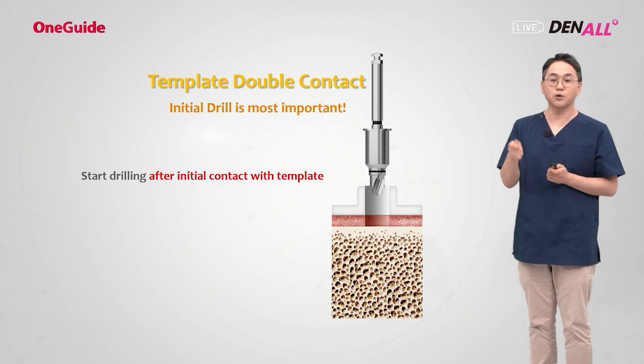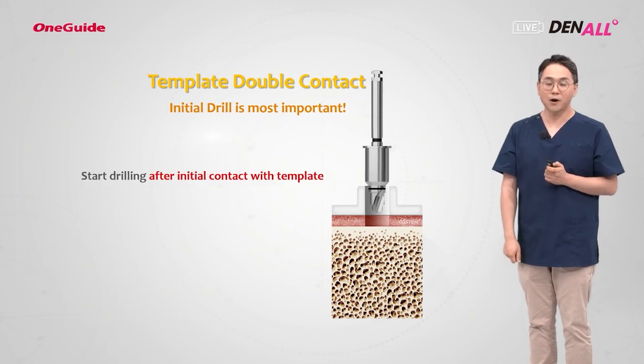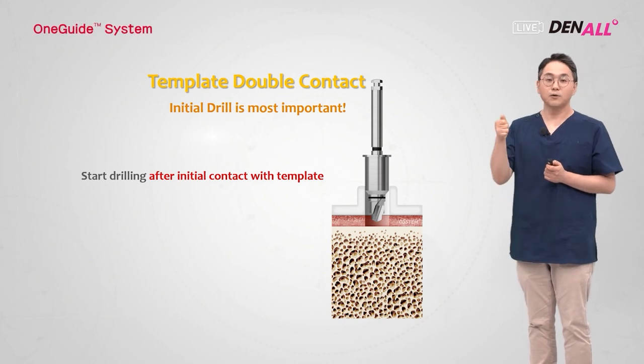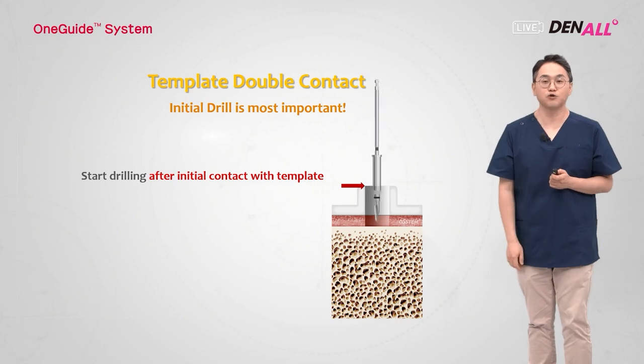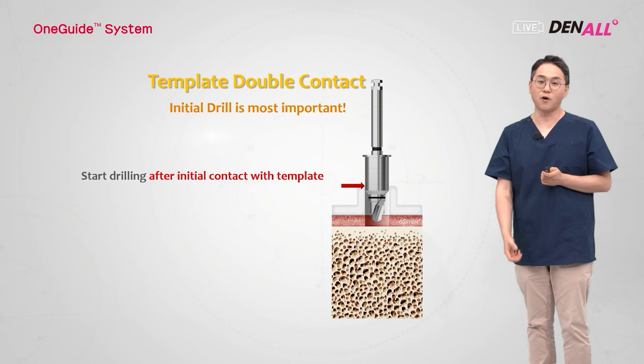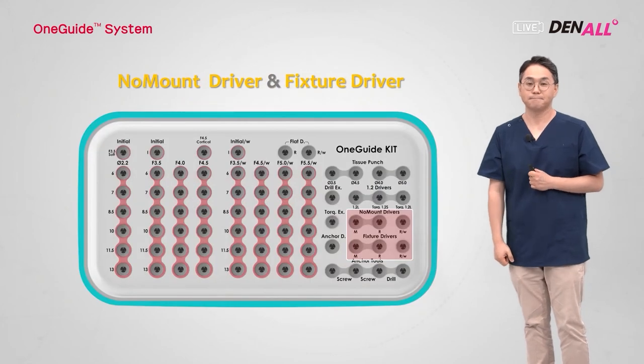So don't rotate the initial drill outside of the mouth, but push it down through the guide hole without rotating until the guide barrel touches the guide hole. And then rotate it by stepping on the pedal to make the drilling go as planned.